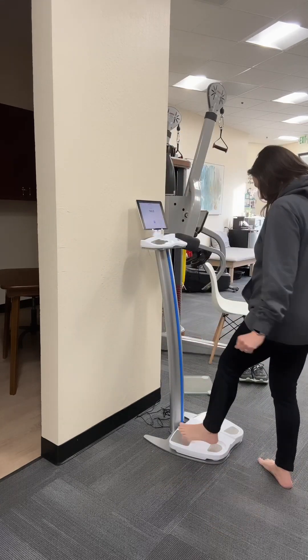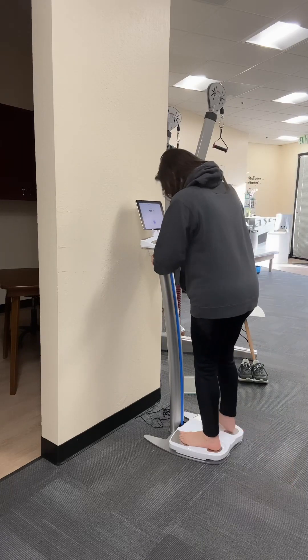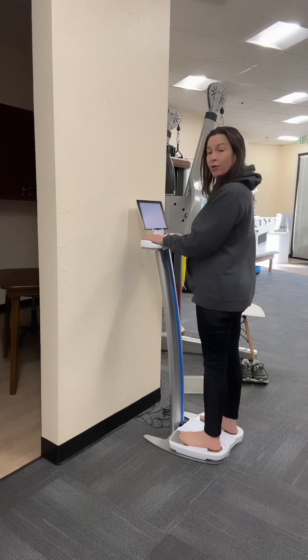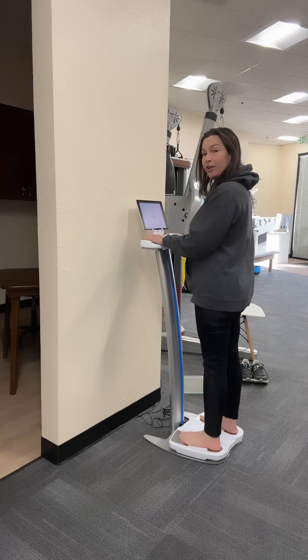Good morning everybody. I want to show you the value that this Sozo machine brings to our practice here at Oasis PT and Wellness. I just got off the scale and I am standing on the sensors on the platform of my Sozo machine, and it's counting down. It is going to start sending frequencies through the sensors up both of my arms and my legs.